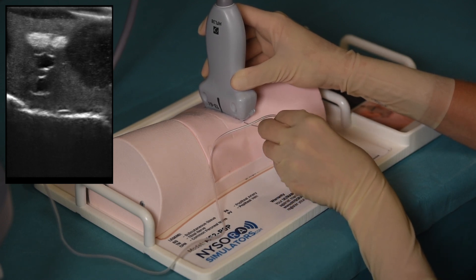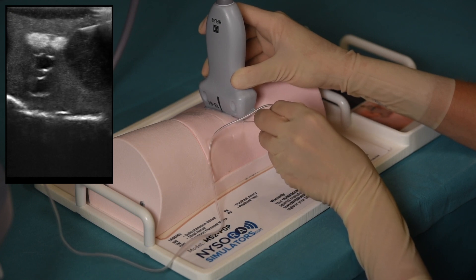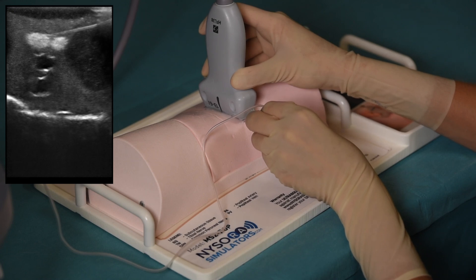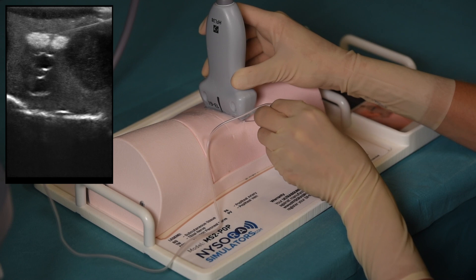In this particular example, the needle is placed in plane to approach the sciatic nerve in the popliteal fossa. The angle of the needle is gradually adjusted until it pierces the sheath, where the injection in a popliteal sciatic block would be made.